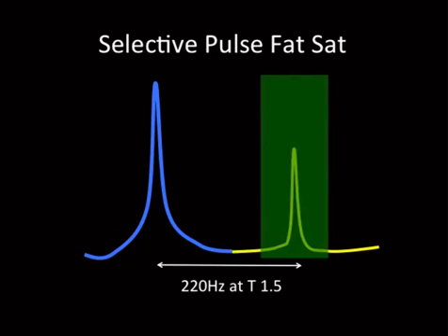And the excitation RF pulse is then applied to the slices, and the magnetic moments of the fat nuclei are flipped into saturation. So if they're flipped to 180 degrees, they don't have a component of transverse magnetization, and they produce no signal.